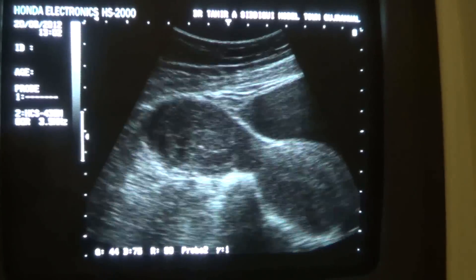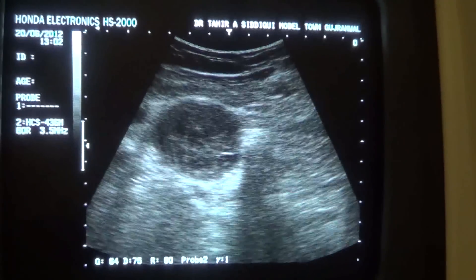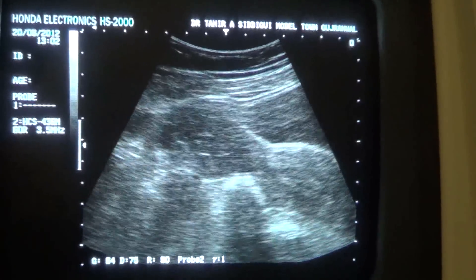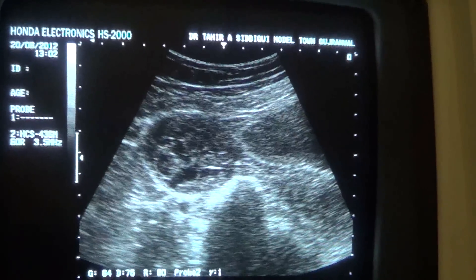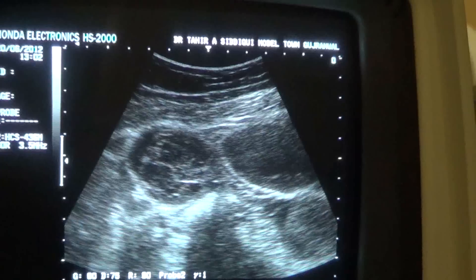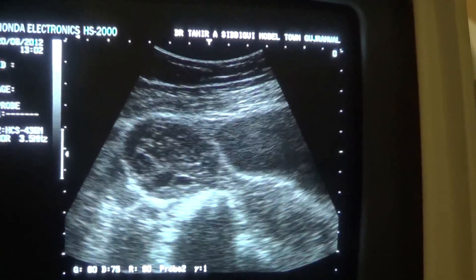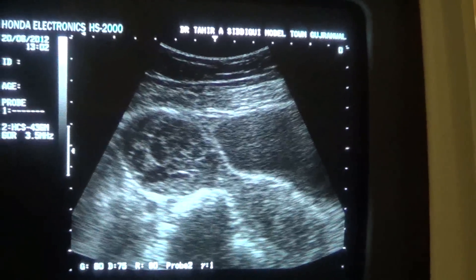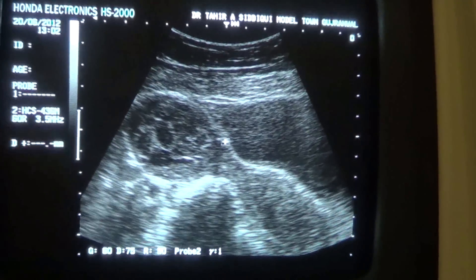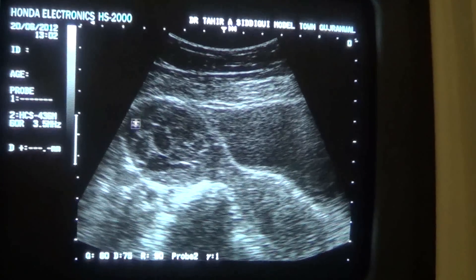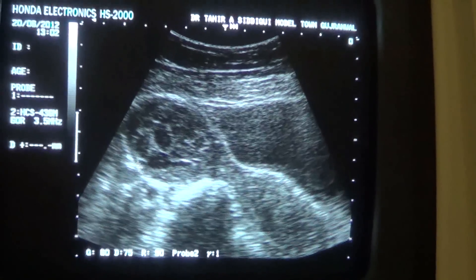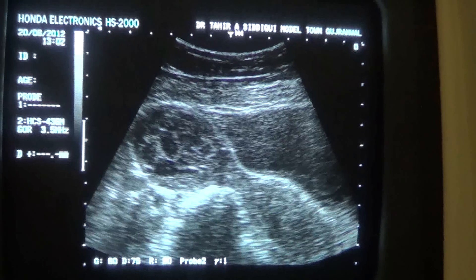The right ovary gives the same picture. See the number of follicles. The follicles are not arranged in the periphery; rather, they are distributed throughout all of the ovarian stroma with a small amount of fluid. This is the outer surface of the ovary — the capsule of the ovary.